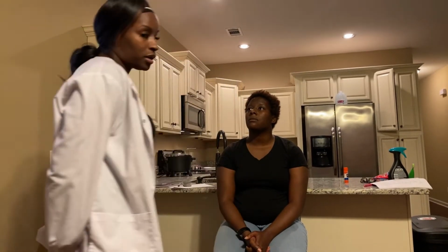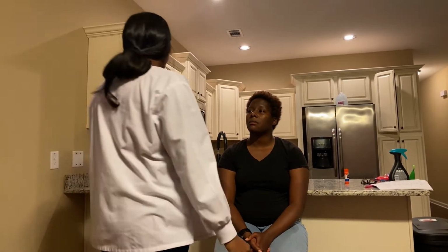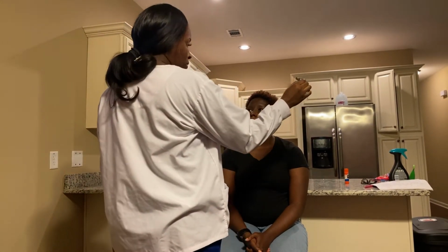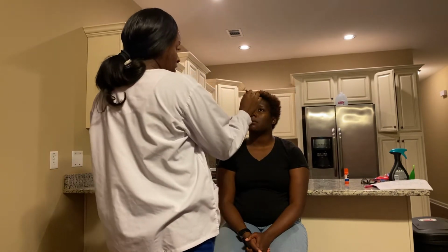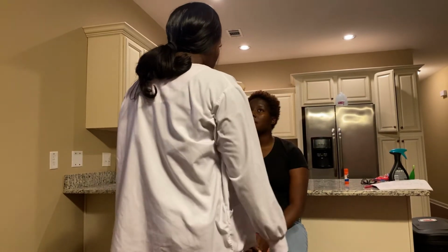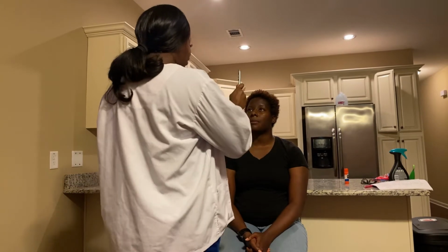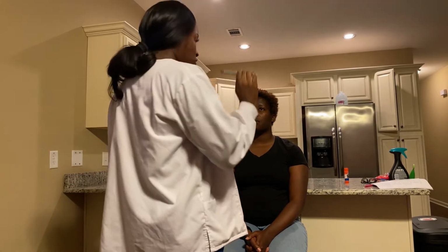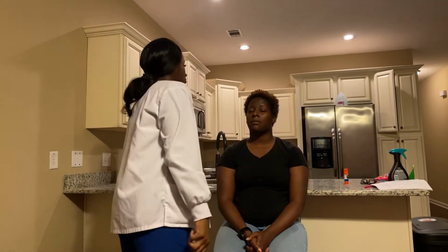Then I can assess PERRLA, which is pupils equal and reactive to light and accommodation. I will dim the lights, and then I will come in from the side. And when the light touches them, they should constrict, and when you move it out, they should dilate. And I check accommodation by holding the penlight, and the patient will watch it as it goes over my shoulder, and that would be accommodation. Ophthalmoscope, we can use that to check the retina and other parts of the eye.